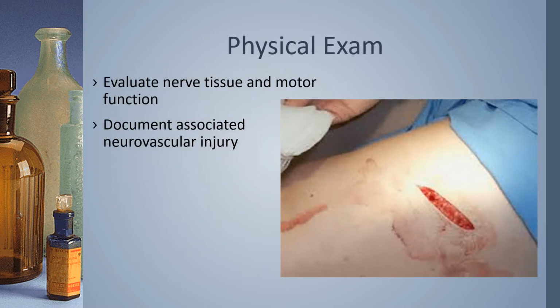The management of a minor laceration begins with the assessment and preparation of the wound, which includes that history. So to assess this wound, you need to determine the mechanism of injury. How old is this injury? You need to identify the possible contamination or foreign body. You need to assess the extent of this wound, which can be painful, so do not be afraid to numb the area up first before you explore. You also need to do an assessment for neurovascular compromise and tendon injury in the surrounding area. You have to check if the patient needs tetanus prophylaxis and identify risk factors that might affect healing.